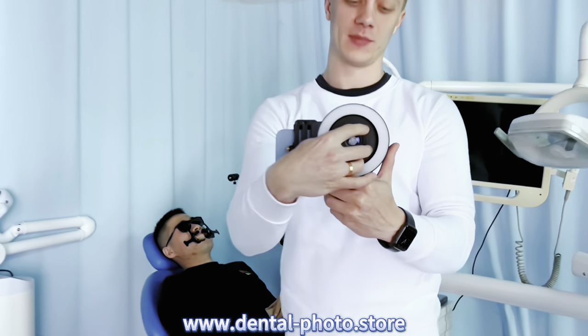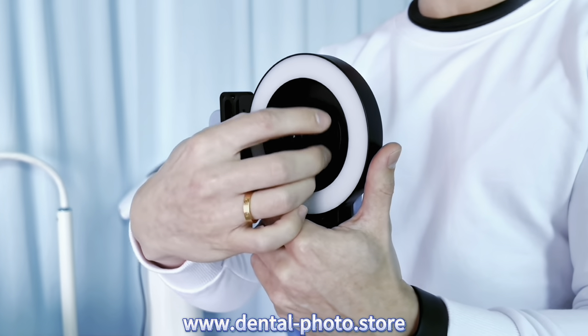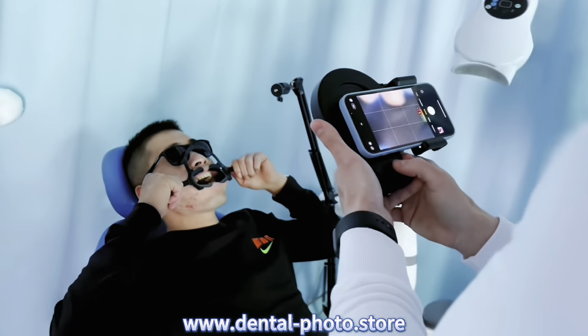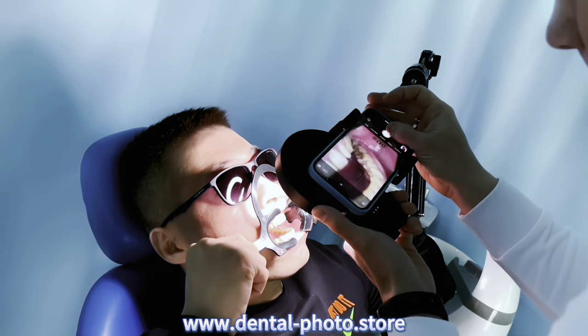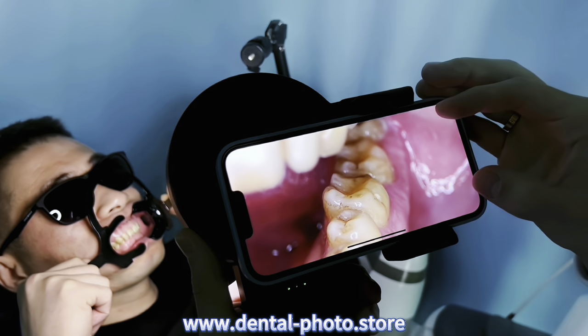And now let's use MK23 with the 100mm macro lens. This is the best macro lens for dental photography because it is the real 100mm focus distance and also it's flat, so it has no distortion and we can take photos of the whole oral cavity. I'm going to use the same cold light on the maximum brightness. And first let's take a photo of the molars. As you can see with this macro lens we can take photos of molars.